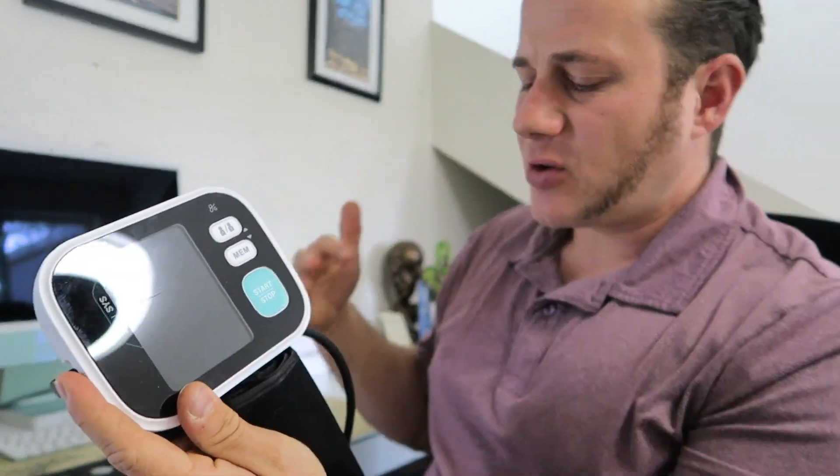It doesn't get too tight or feel uncomfortable using it, like some I've used in the past. It also comes with an app.